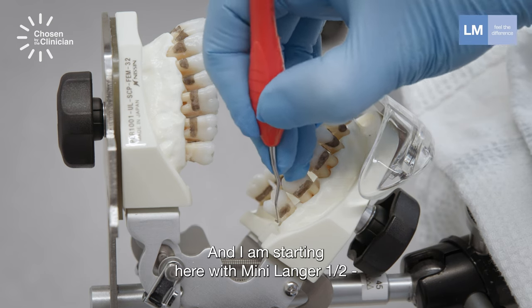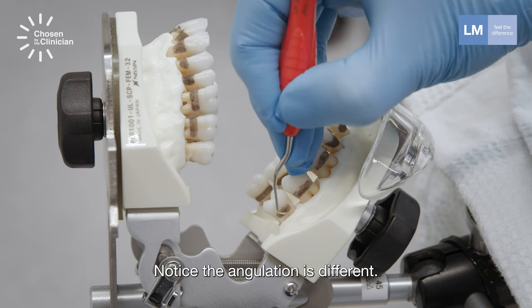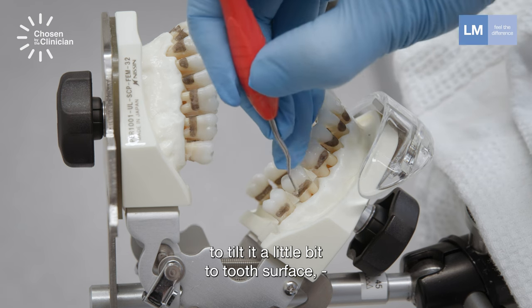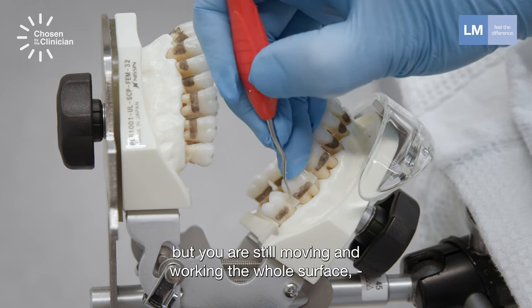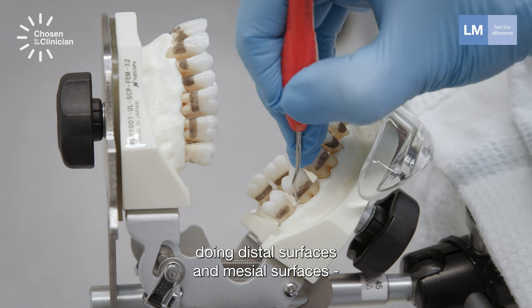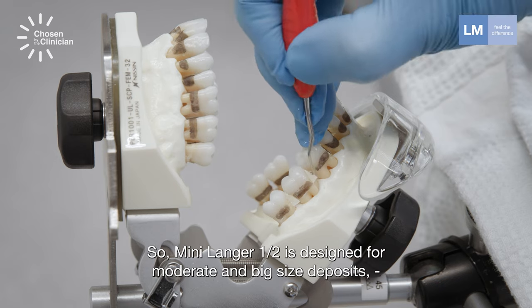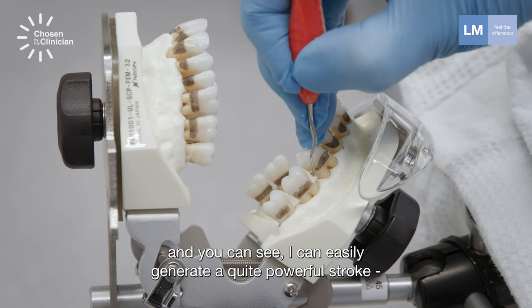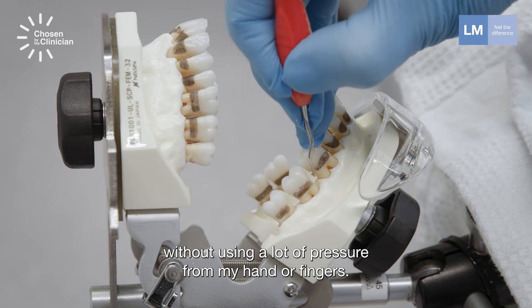I'm starting here with Mini Langer 1/2 in the lower jaw. Notice the angulation is different — Langer is a universal curette, which means that you need to tilt it a little bit to the tooth surface. You are still moving and working the whole surface, at least half of it, doing distal surfaces and mesial surfaces with the same instrument. Mini Langer 1/2 is designed for moderate to big size deposits, and you can see I can easily generate a quite powerful stroke without using a lot of pressure from my hand or fingers.